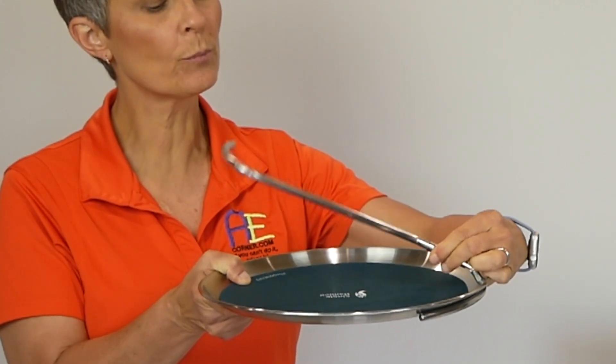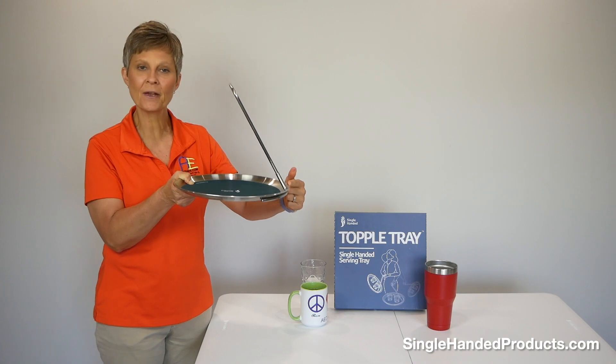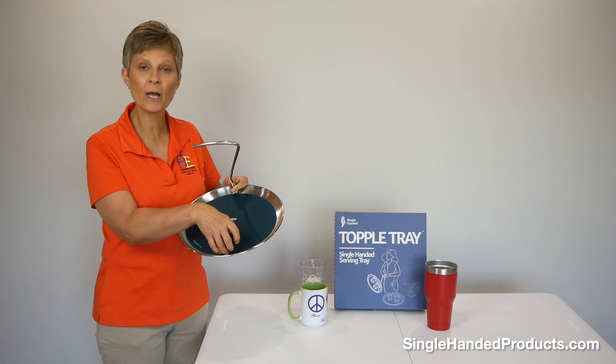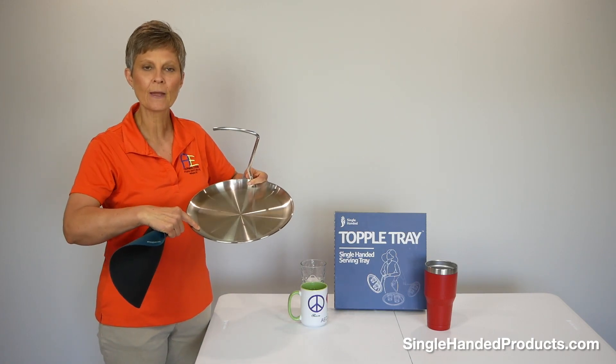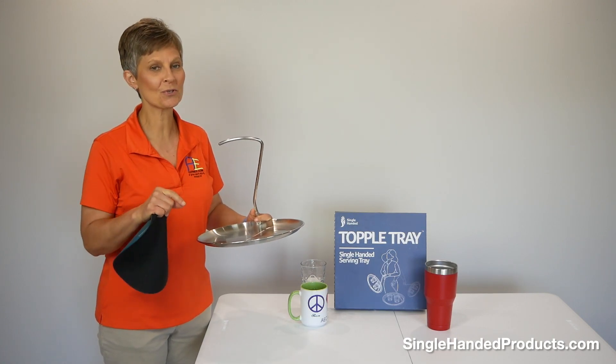And the way you get the handle back up, you bring it up like this, slide that metal tube right back down, and there it is in place. It also has a neoprene anti-slip removable cover with a non-spill edge around this tray. It also has a wipe-clean surface. The best part about it is it's dishwasher safe.